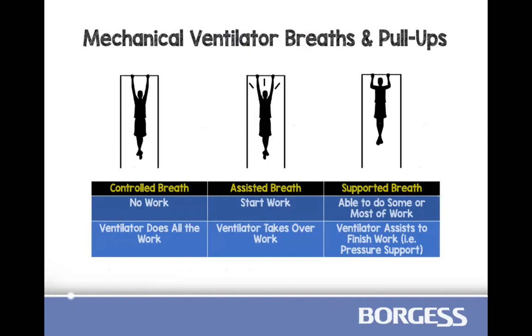If you just sort of hang there and you do nothing, that's the ventilator doing all of the work. You're not actually going to do anything. The next one is you start to do a little bit of work, but the ventilator takes over and actually does the rest. Or in a supported breath, you're actually doing all of the work, and maybe you're just getting that extra little push at the very end. But truly, you're the one doing the work, okay?